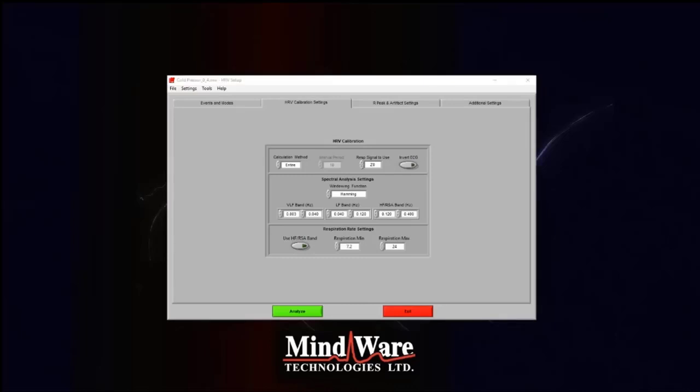Okay, so this next one is for RMSSD: how do we analyze the numbers? Basically, does a lower number mean there's more parasympathetic control? And in what situations would you actually use RSA versus RMSSD? So RMSSD is easier to calculate. It's often produced by devices that calculate in real time or do not record the raw ECG data. But if you do have the raw ECG data and respiration, then RSA is more commonly used.